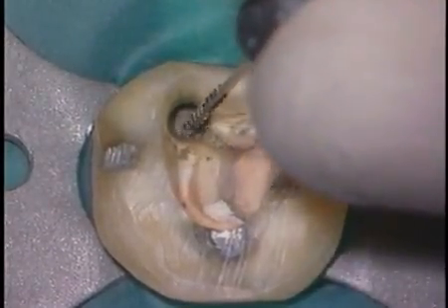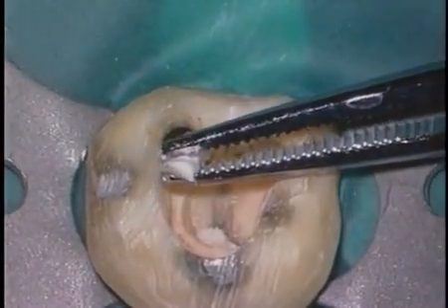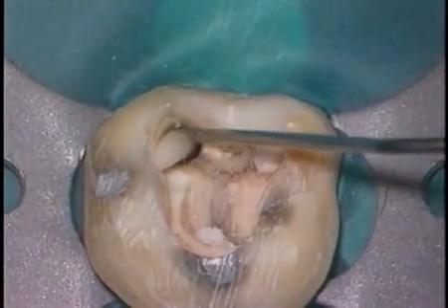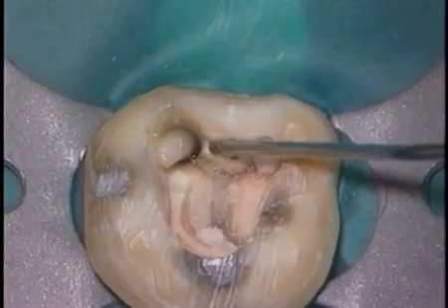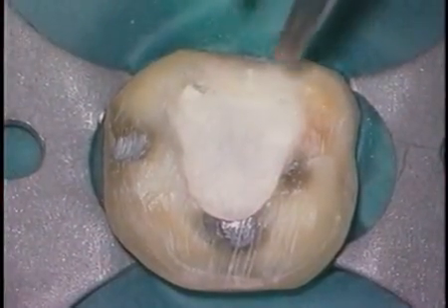Remember, MTA likes moisture to set up hard, so we'll place a paper point down in this canal. We'll use an irrigating syringe with water and let water run down the paper point, and then we can close the case. We can have the patient come back anytime after 4 to 6 hours.